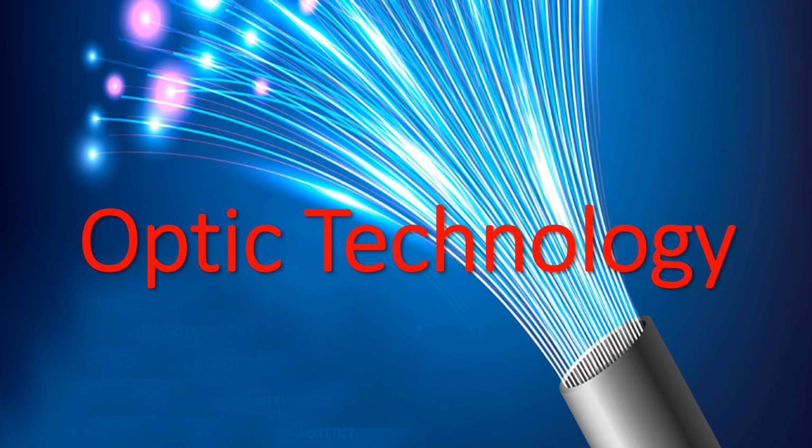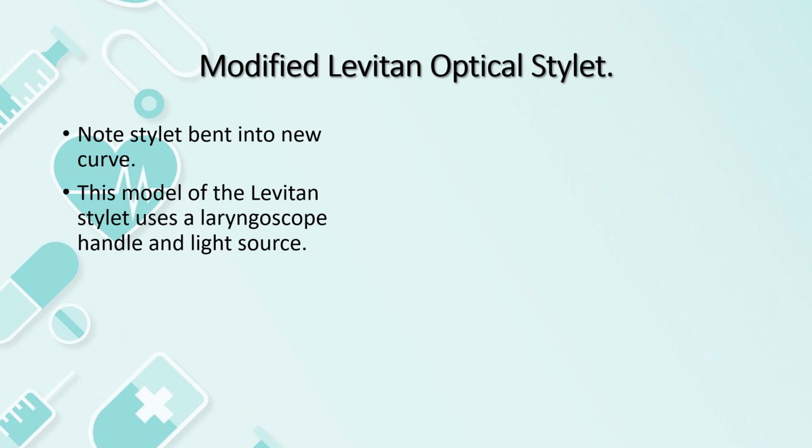Now, optical technology provides some kind of evolution in the stylet industry.